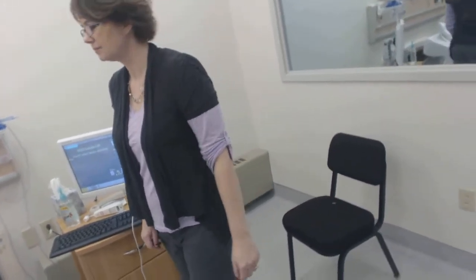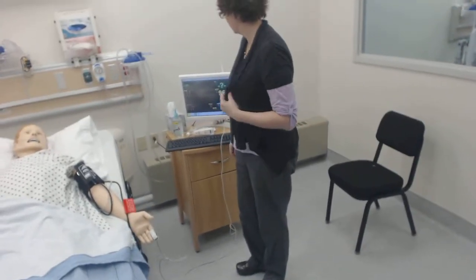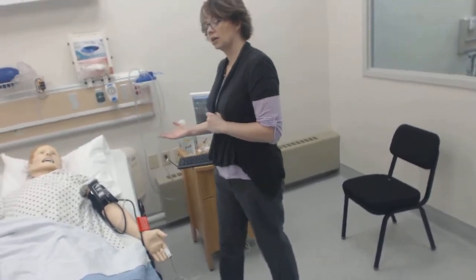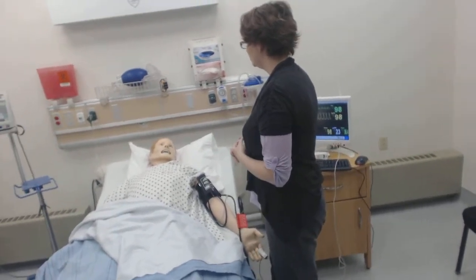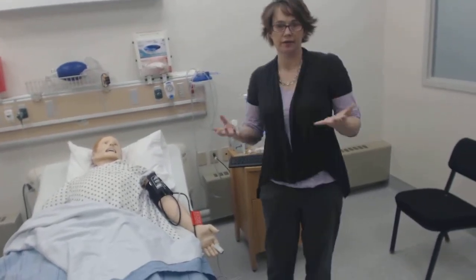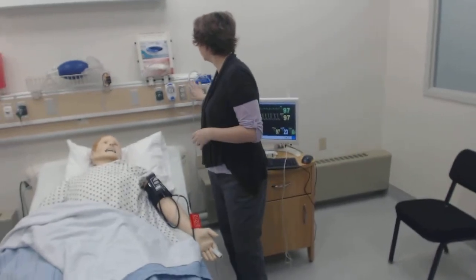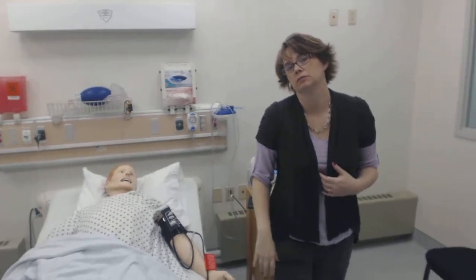Go ahead and start it. You're just going to touch where it says touch. Then I'm going to take a blood pressure using the monitor, so I'm going to hit start. I'm going to start talking to my patient, do my assessment. When I notice that something's wrong, I've got lots of things that I can do, right? I can call the doctor. I can get some help in here. I can continue with my assessment. Remember that suction is up here. There's gloves. There's an ambu bag. There's oxygen. Okay?